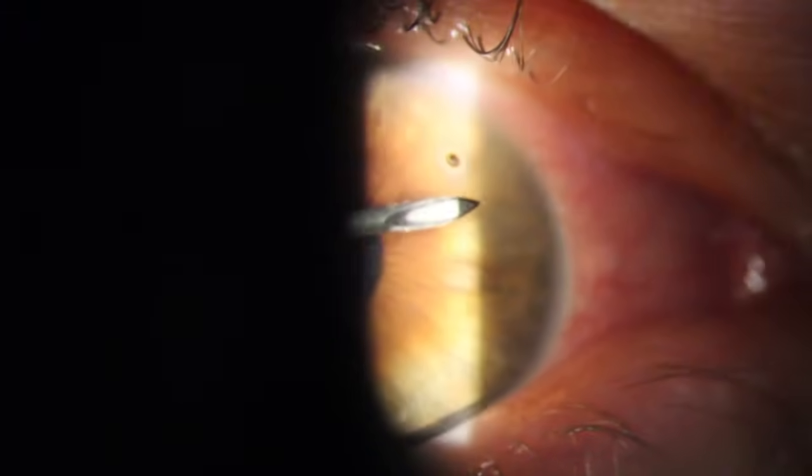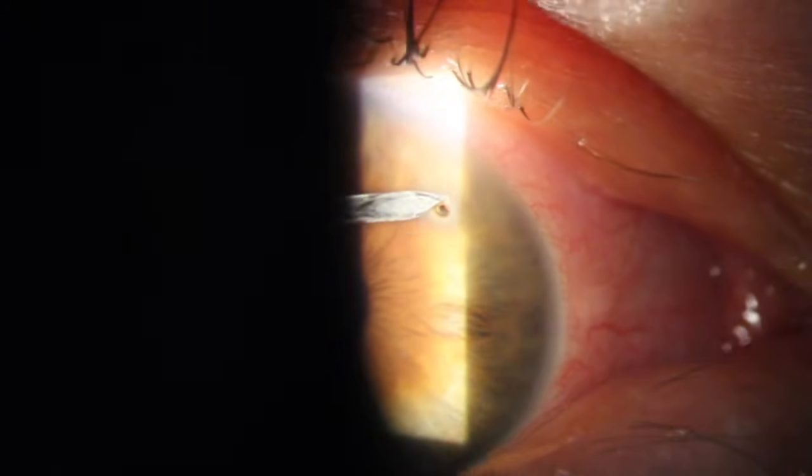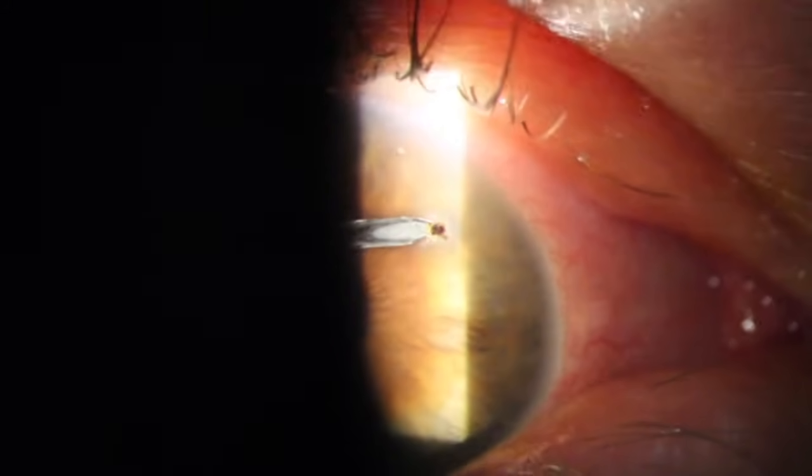You can see with all of these procedures, I'm using a needle that's just kept parallel to the eye, with the patient fixating in the distance and the light is kept out of the pupil.